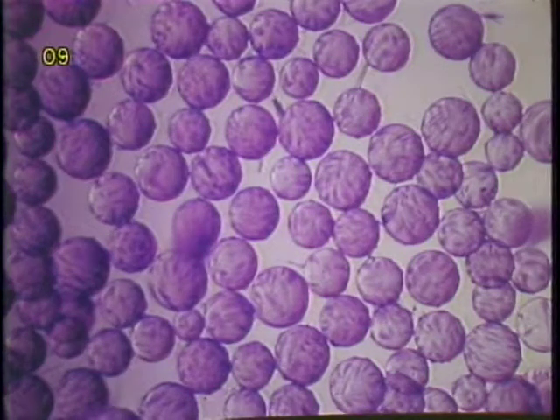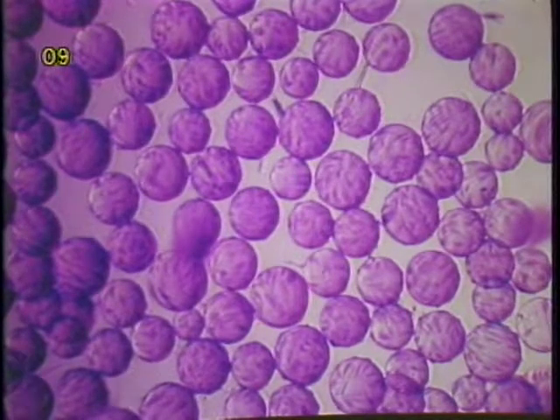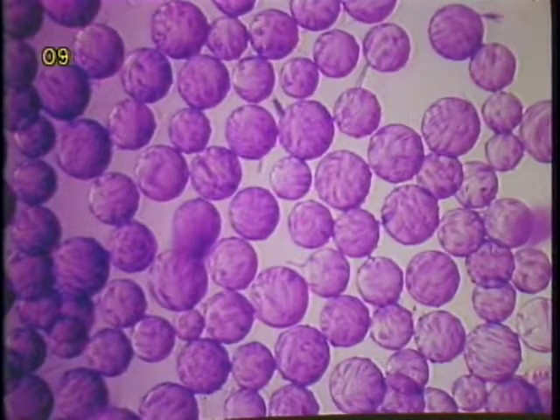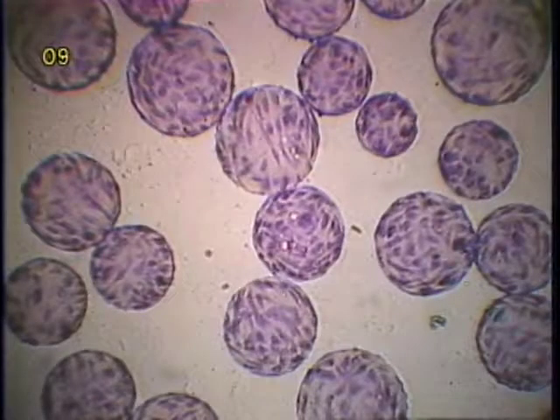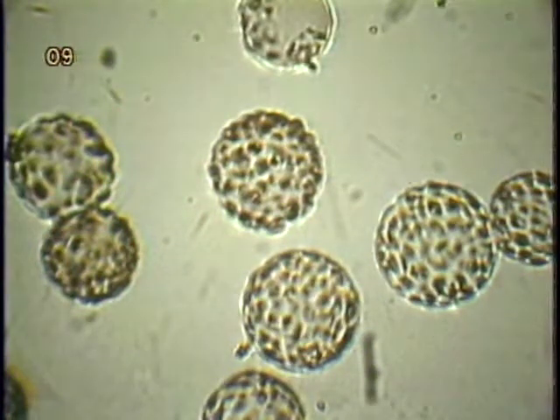These cells exhibit typical social behavior of normal diploid cells and often grow in polarized fashion, as typically observed on Petri dishes. Confluence is readily achieved in a few days, and cells do not grow beyond the confluent monolayer stage as on microcarriers. The morphology of continuous epithelial cell lines such as Vero cells is very different from normal diploid cells.